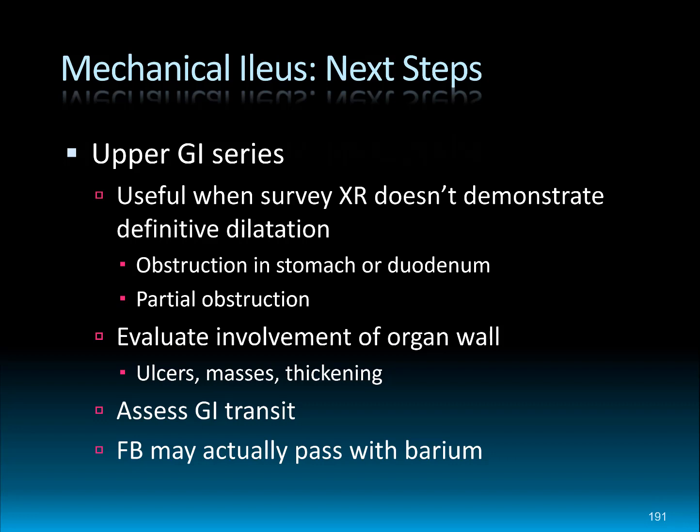Every now and then, the upper GI series will be therapeutic. It can actually cause the foreign material to pass. If nothing else, that barium will coat any ulcers and erosions, and that can help the patient feel better from a gastroenteritis sense as well.